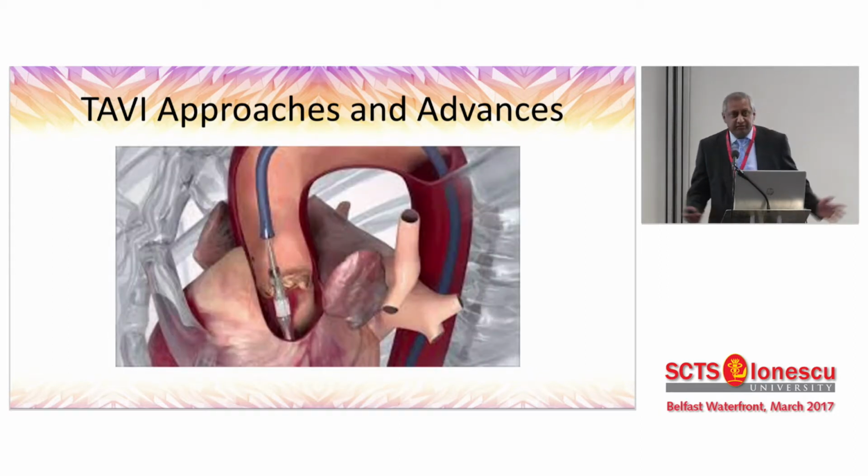The device itself, the delivery of the TAVI through the transfemoral route, is very easy. Most of these procedures take under an hour, and I think in our practice, the access point, if it gives us trouble, probably takes longer to sort out than actually delivering the TAVI valve.